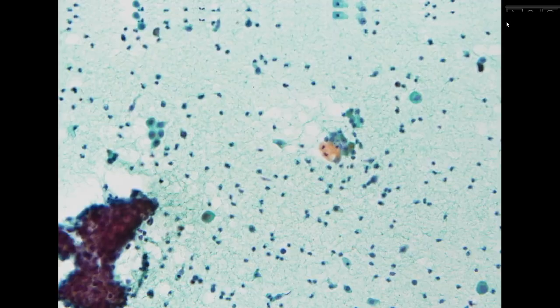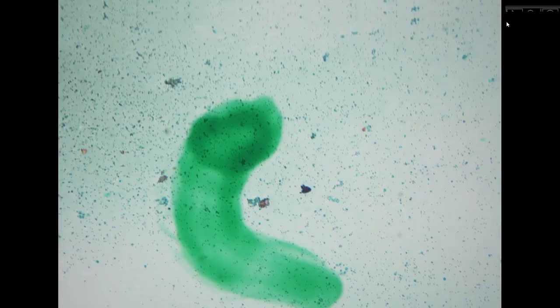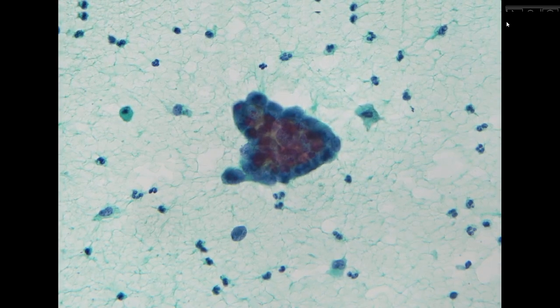The patient currently seems to be under a clinical trial or something like that. So this seems to be a recurrence of the disease, just based on this cytology smear. Okay, so we will sign these out as adenocarcinoma, and this is not a screening smear. This is a disease surveillance smear. So that's all for the cases today. Thank you.